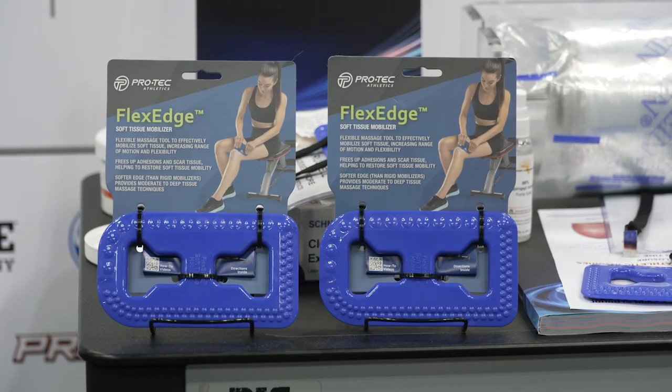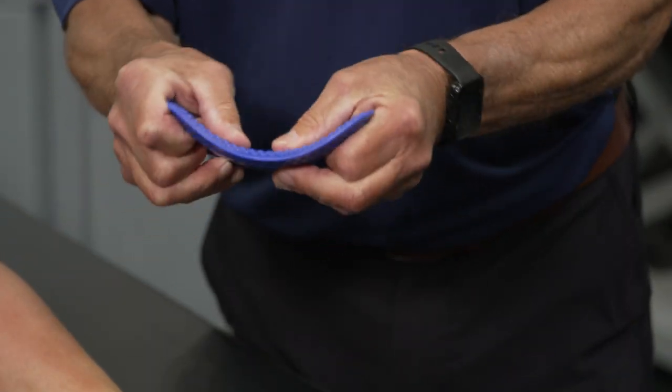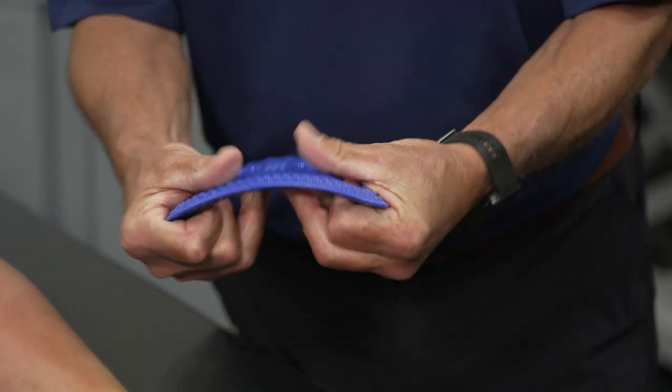This is FlexEdge, a flexible soft tissue mobilizer. I can shape it to any contour of the body that I'm working on.